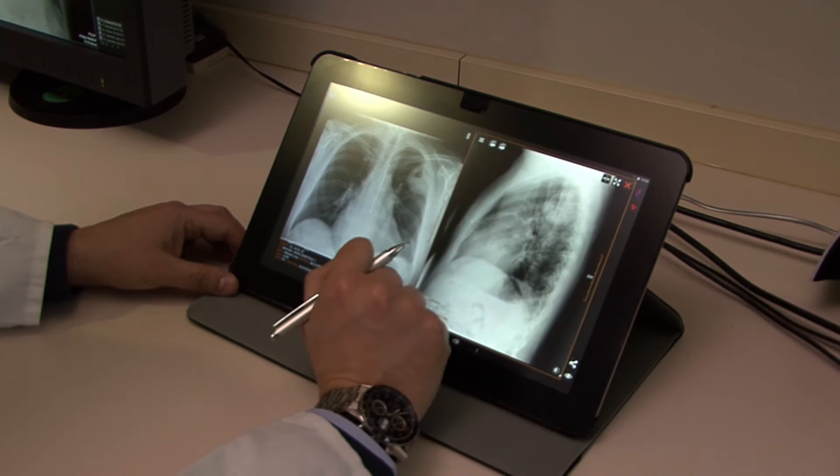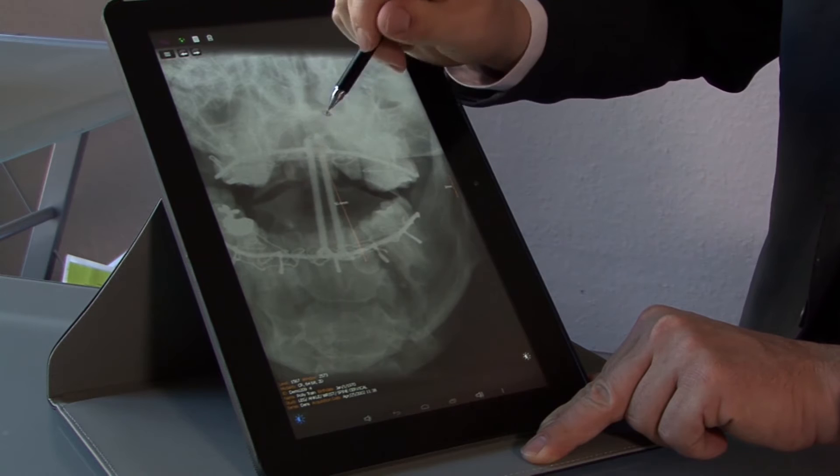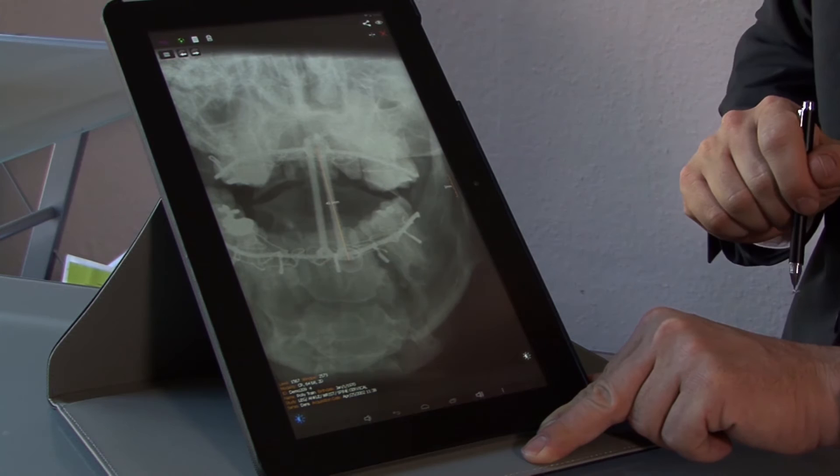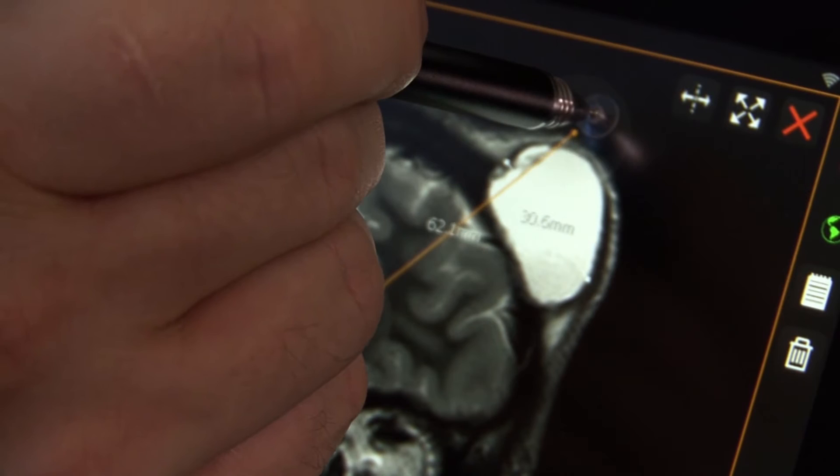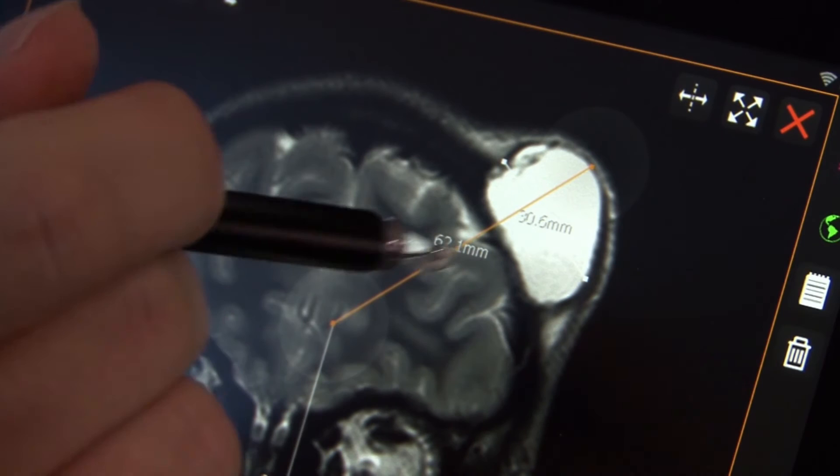But it's really challenging for the human eye to determine whether the ambient light is okay or too bright. That's why we've built an ambient light sensor, which gives a traffic light indicator to visualize whether the ambient light is okay, limited, or not acceptable for image visualization. The finger measurement is not accurate, so we developed a special pen with a translucent tip, and using that tip you can do measurements on screen in a precise way.